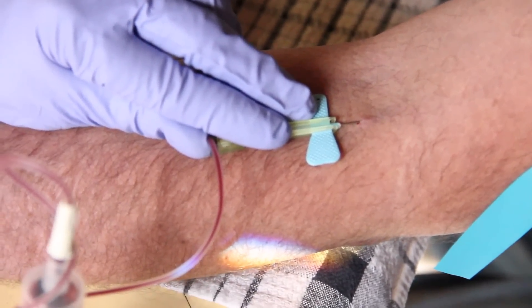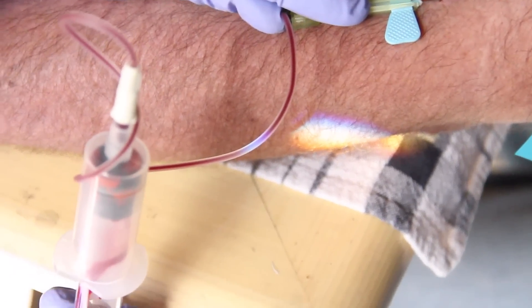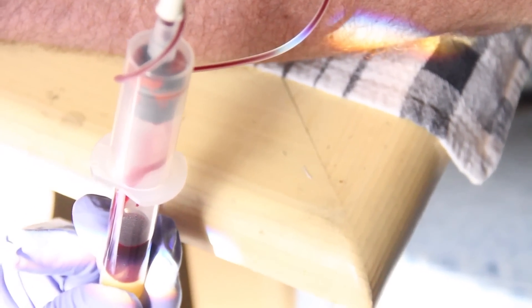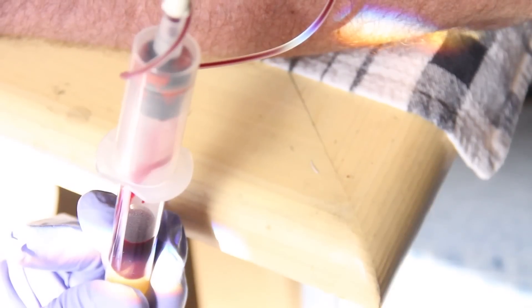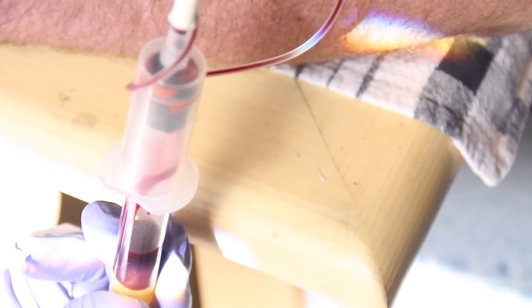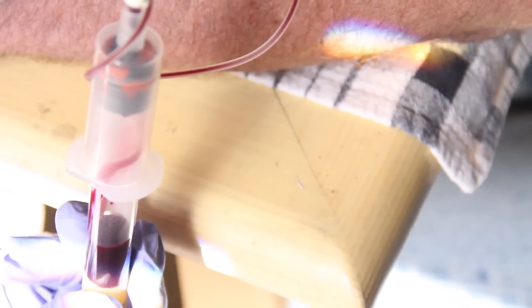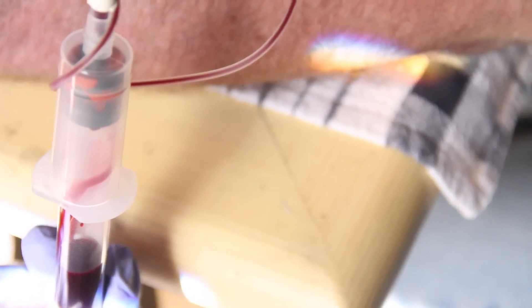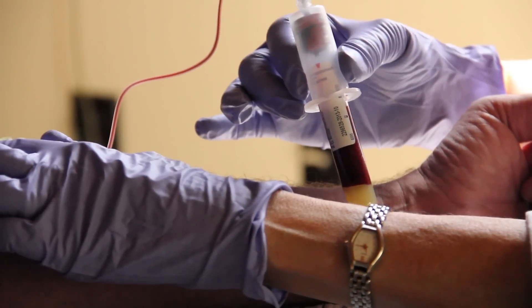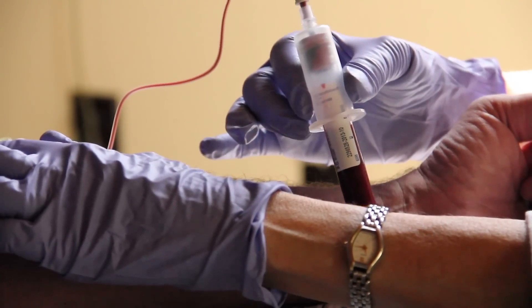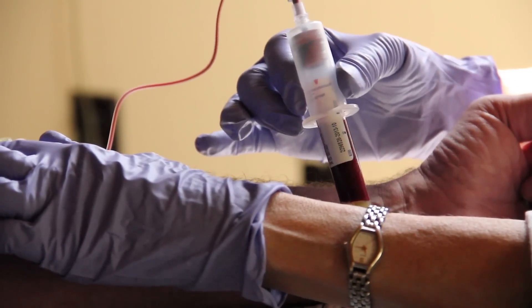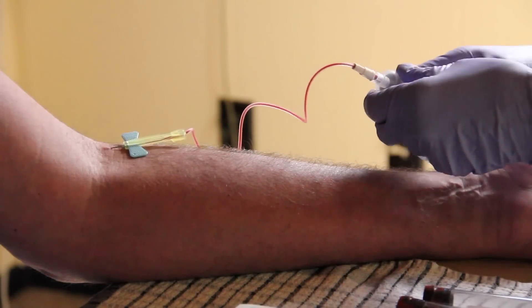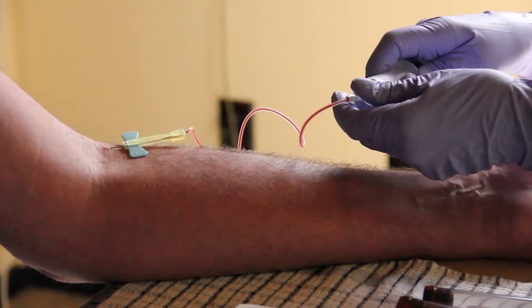I bought the needles with a prescription from my doctor. I also bought a case of SSTs, these serum separation tubes, online from the same medical supply house. 16 tubes is convenient because the centrifuge I bought online for $190 has eight slots, so I can do two flights of eight tubes spinning 3,300 rpm for 30 minutes.